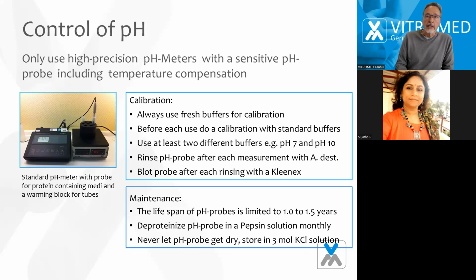Okay, control of pH. This is a special thing, but very important. You should use really high precision pH meters with sensitive pH probes, including temperature compensation. This is not really necessary, but it helps you to make it easier.